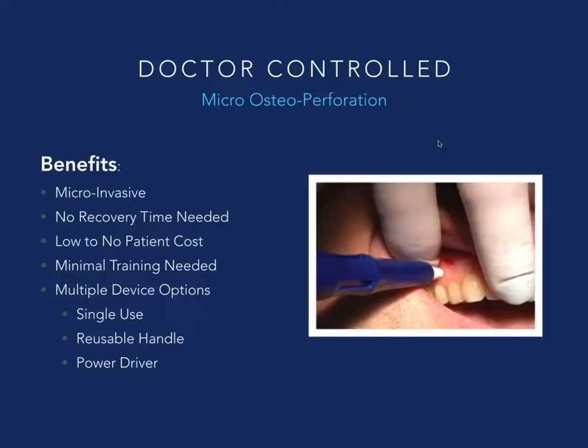My only complaint, or only issue in my hands, was not having as much tactile feedback. I think that really comes down to your clinical preference, but you won't get nearly the feedback as you do with a powered driver. And then you'll have a little bit of a difference in the speed of being able to provide the Propel treatment. With the reusable handle and going through multiple sites, it rarely takes me longer than 4 or 5 minutes to provide Propel.